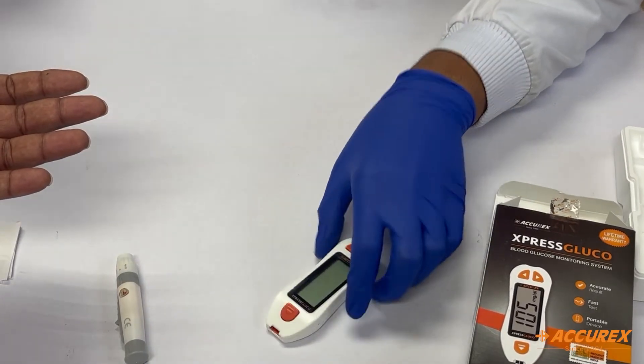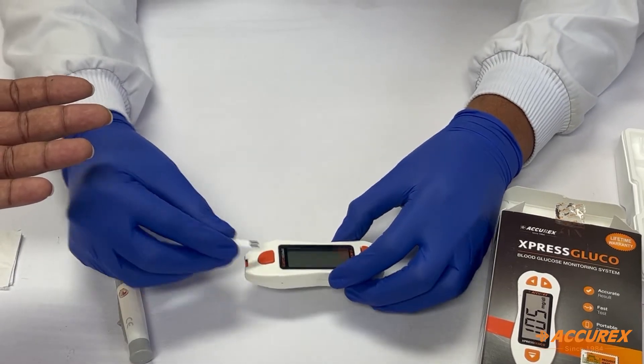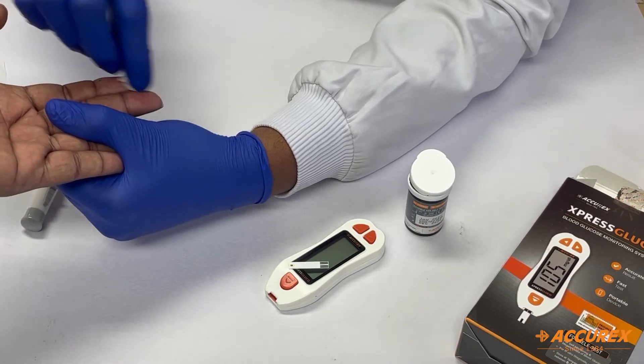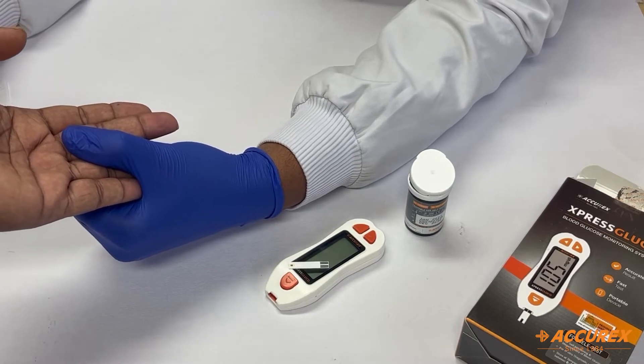Now let's start the testing. Take a strip from the strip bottle and insert it in the monitoring system. Before inserting the strip, clean the finger with the help of an alcohol swab and allow it to dry properly.